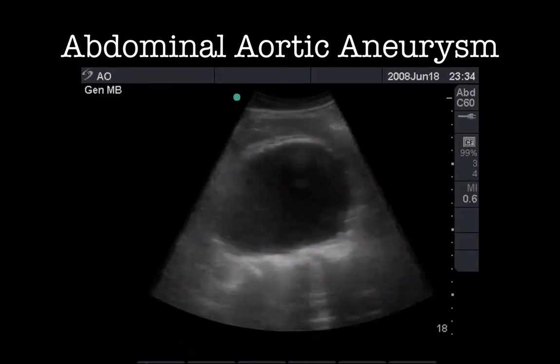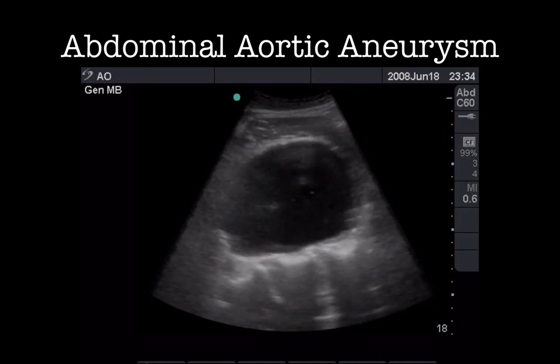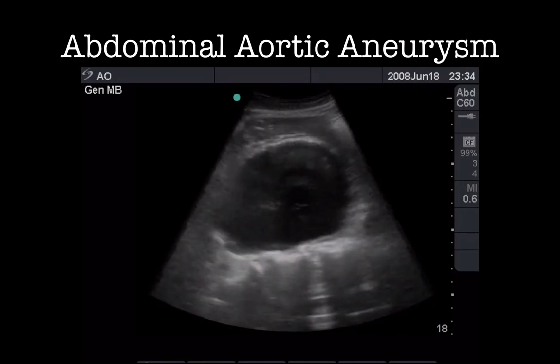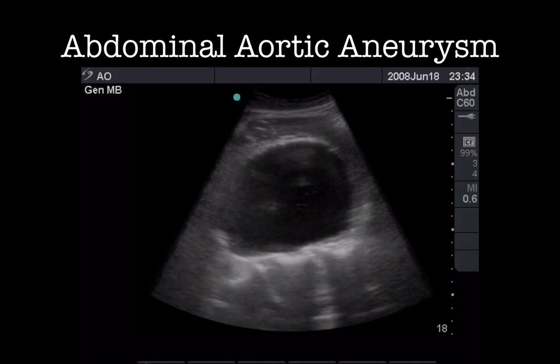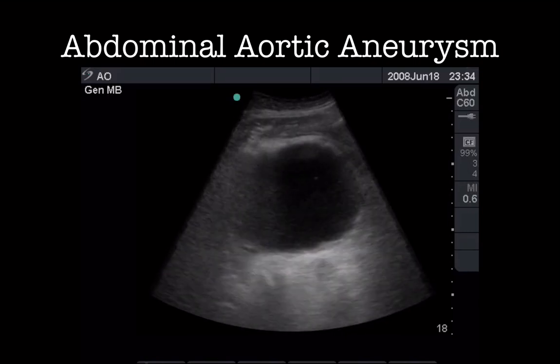Here's a little bit different view of that aneurysm. You can see how it's not a perfect circle. That really doesn't matter. What we're looking for is a dilation. So remember, anything bigger than 3 centimeters is a dilated aorta, and then we need to figure out what we need to do to treat that disease of that aneurysm.